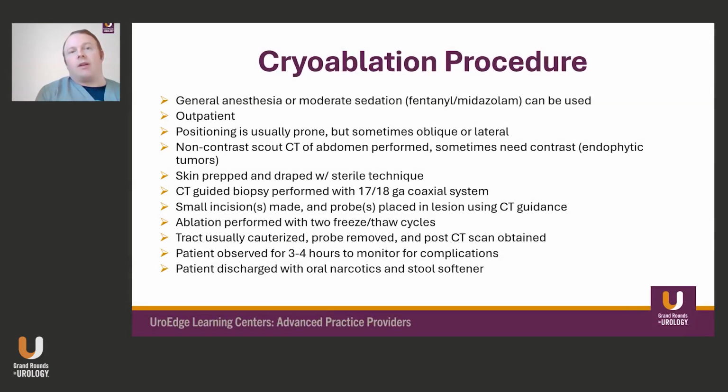Okay. So traditionally, interventional radiologists would use general anesthesia when doing cryoablation. That's the way I was trained in private practice settings, and I think more commonly, even in academic contexts. We're now using moderate sedation, just fentanyl and Versed, with RNs administering this. It's done on an outpatient basis.